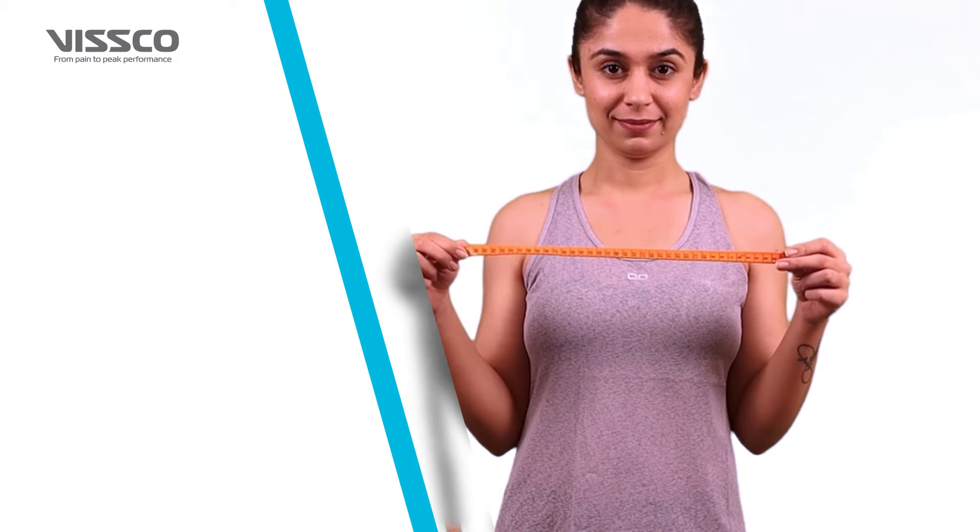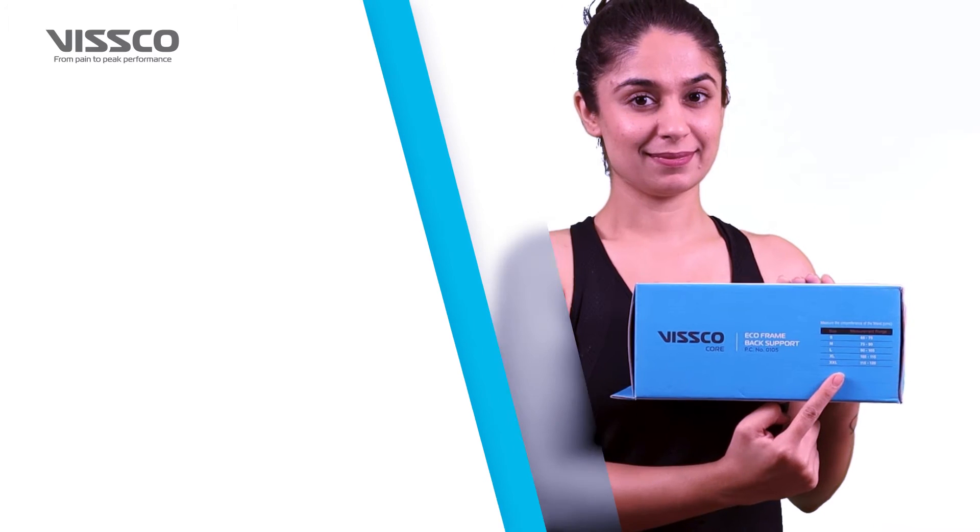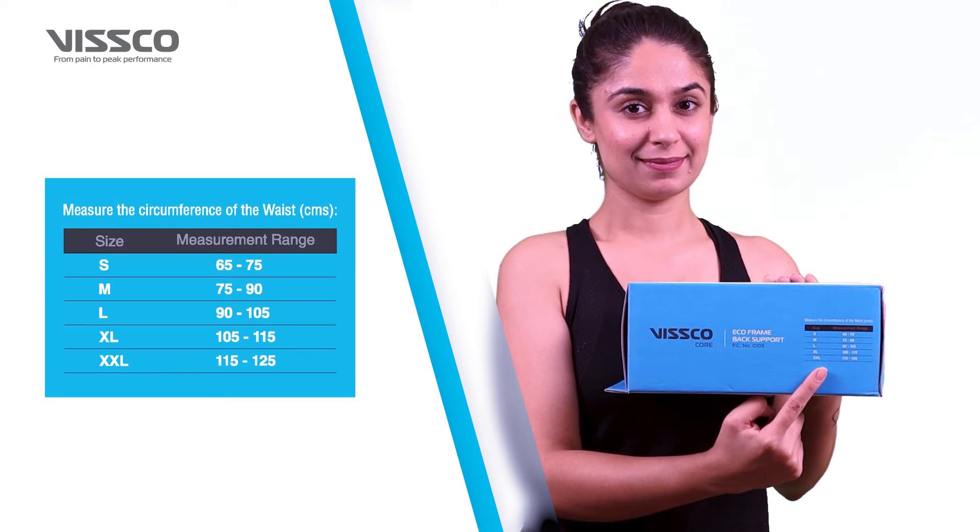It is important to select the right size. Take a measuring tape and measure the circumference around the waist. You can then select the appropriate size from the chart on the box. Available sizes are small, medium, large, extra-large, and extra-extra-large.